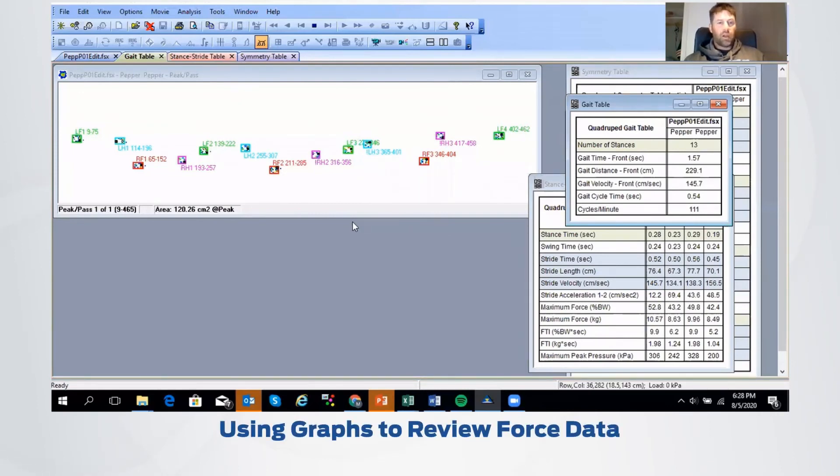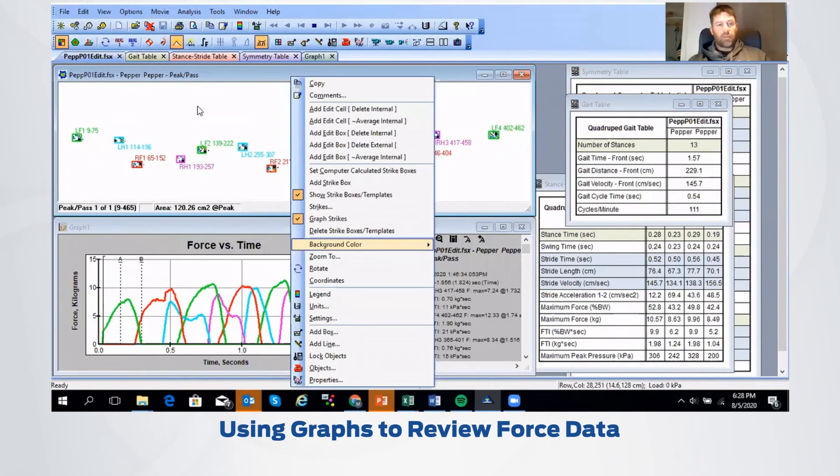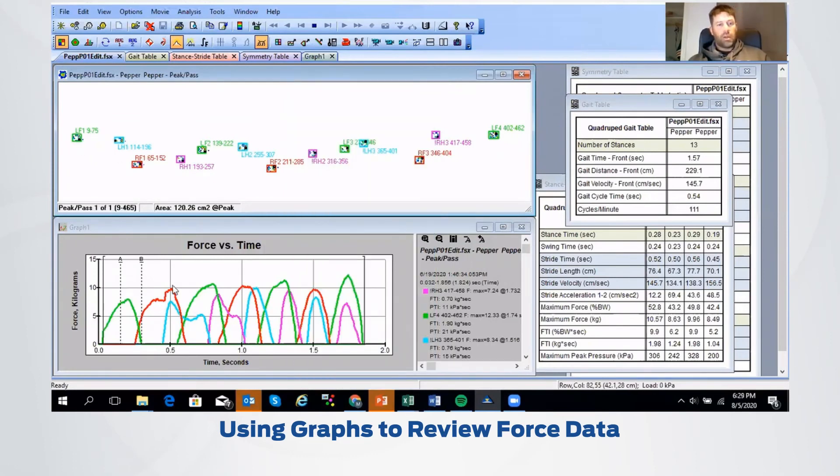Another thing I wanted to show is how to graph these strikes and look at the force information. I just right-clicked here and graphed the strikes — you can see green is our left front, red is our right front, blue is our left hind, and purple is our right hind. You're seeing those curves generated here, and they're fairly similar to each other. We're seeing some changes in some of these curves, which I attribute to the pulling effect of Pepper with my son trying to get to the treat at the end of the Strideway.